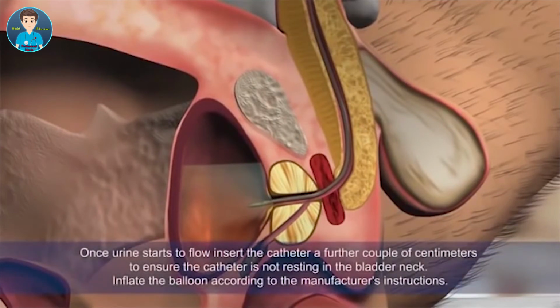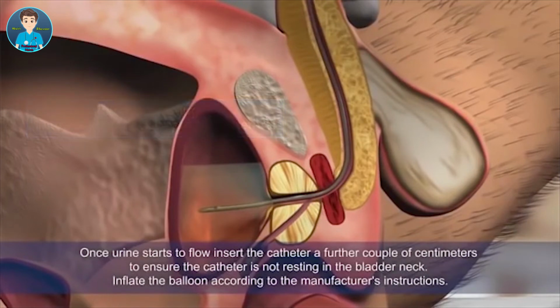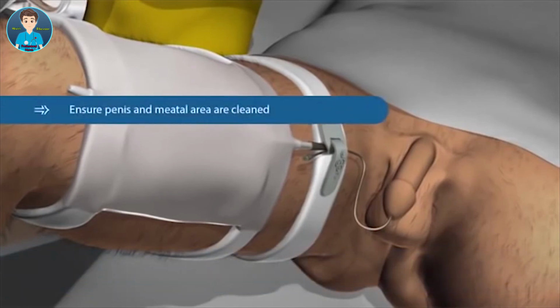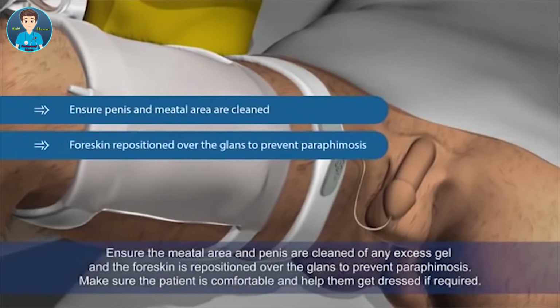Once urine starts to flow, insert the catheter a further couple of centimeters to ensure the catheter is not resting in the bladder neck. Inflate the balloon according to the manufacturer's instructions. Make sure the catheter is supported with a catheter retaining strap to minimize the risk of trauma to the urethra and bladder neck. Ensure the meatal area and penis are cleaned of any excess gel, and the foreskin is repositioned over the glans to prevent paraphimosis.